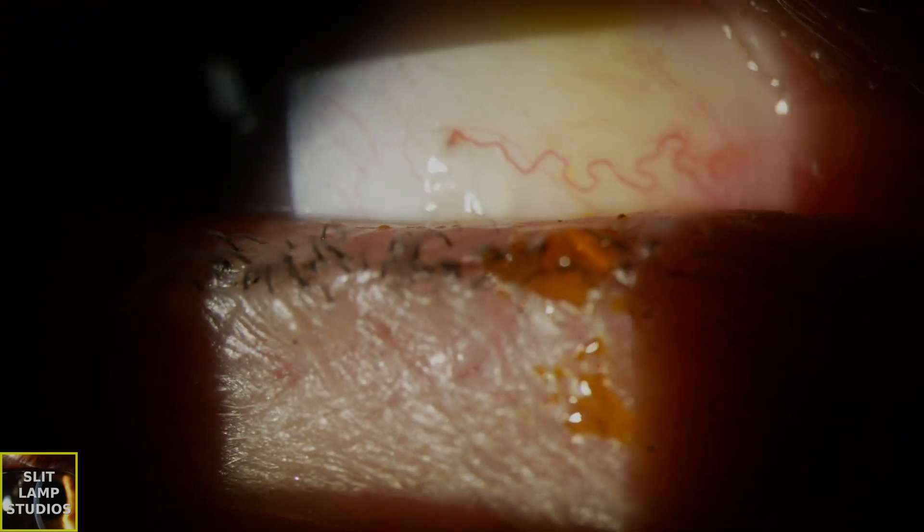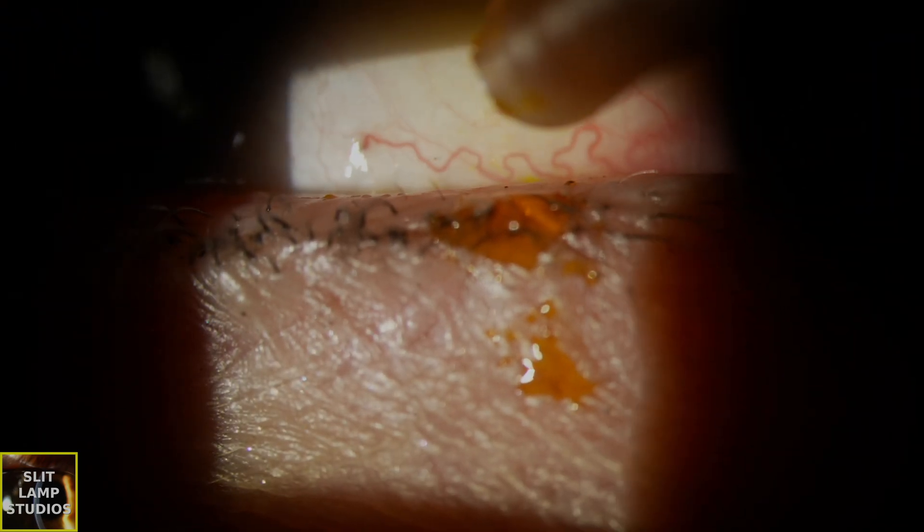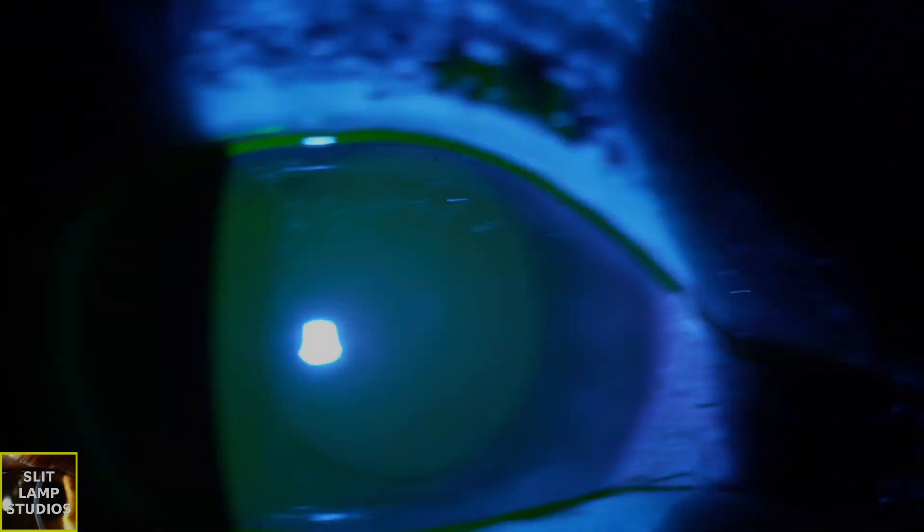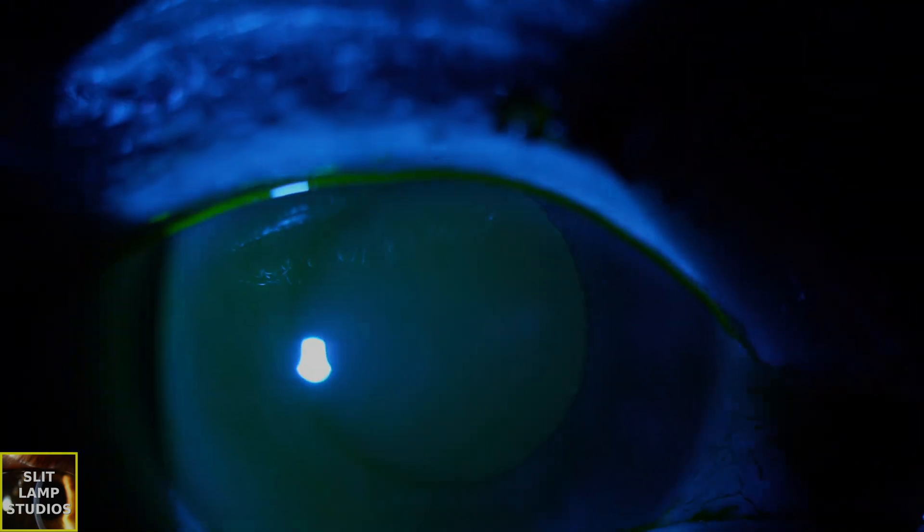We're in a precise specialty, and actually the amount of fluorescein that we need is not even a drop — half a drop, the minimum amount needed. As you can see from this video, that droplet, that bead of fluorescein, that's all you need. By doing that, you're not going to overstain or over-accentuate findings that aren't there, and you'll have a good stain.